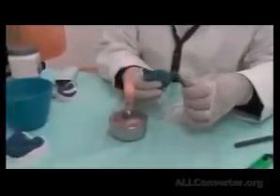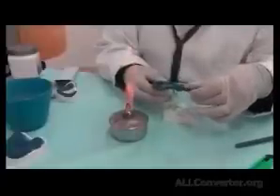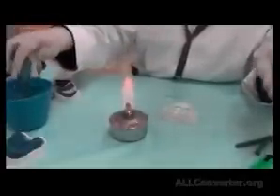So once more, as long as it's sticking, I'm adding. If it doesn't stick, I don't add. And my second, so the first layer was the glue, and the second layer, I'm adding a bit more material to construct the bulk of it. So I'm putting it to a flame, cooling it down a bit with warm water, gathering the material, removing excess, rolling it into a beautiful roll form, giving the final shine, putting it back.